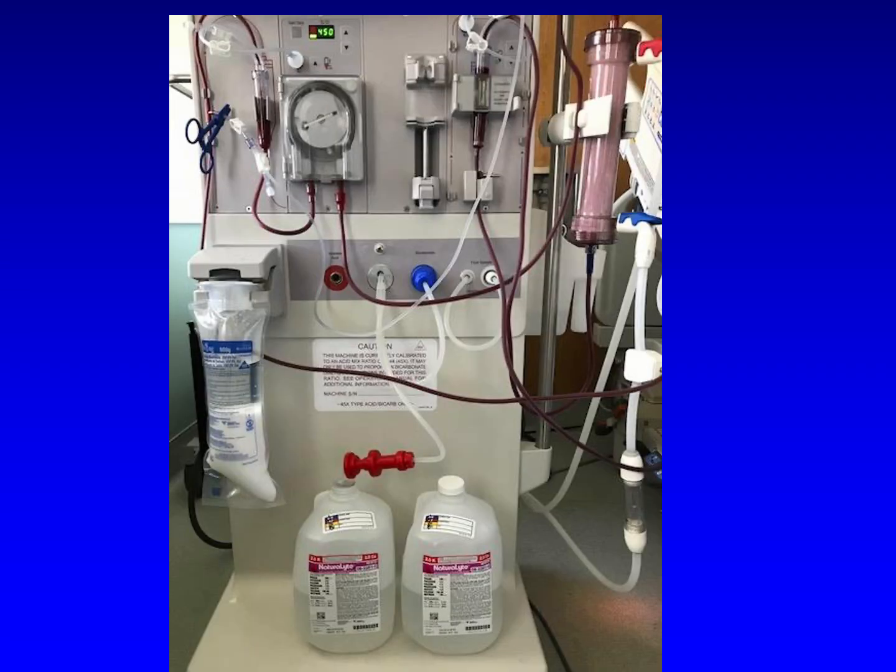The dialysate, which is continuously made by mixing concentrated components with deionized water from large tanks behind the machine, flows through the dialyzer cartridge, bathing the capillaries and carrying away dialyzed toxins, which are then discarded into the drain after a single pass.